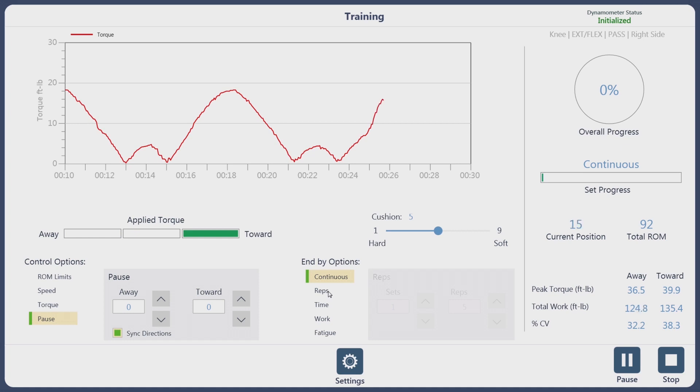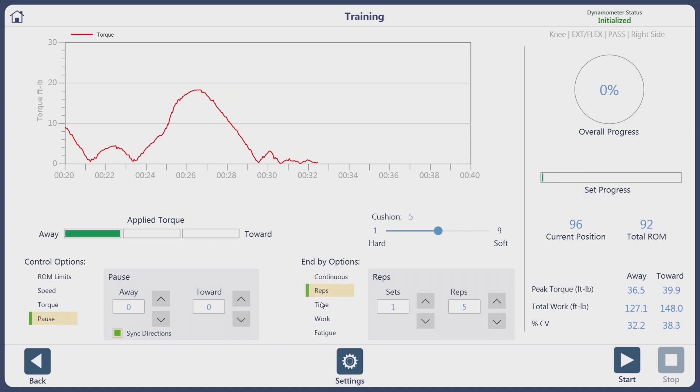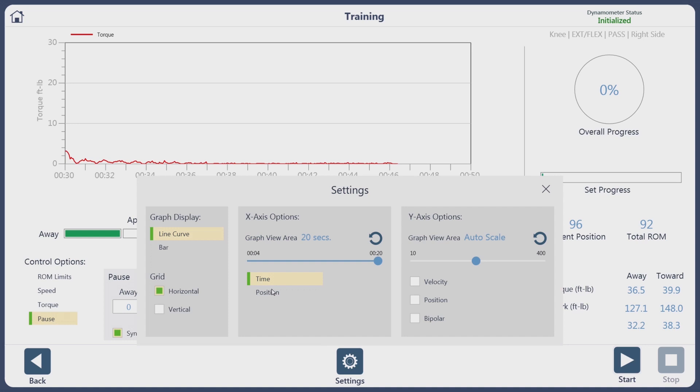You also have the option of changing from continuous gathering of information to just setting repetitions, time, work, and also based on fatigue. The clinician can decide what parameters they want the subject to exercise at.